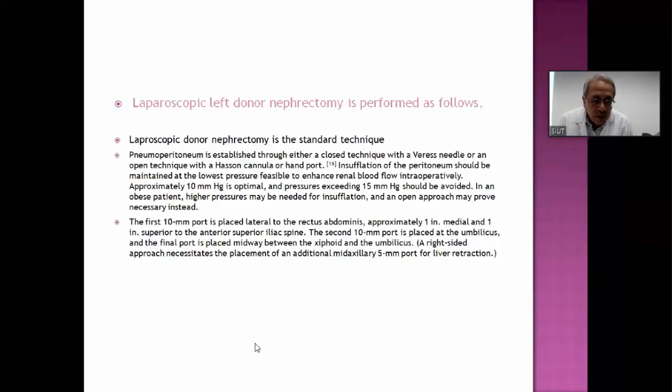The second thing is that excess pressure will always cause the vessels which you are dissecting to go into tamponade, to go under higher pressure. So, for instance, if you are doing dissection and there is some bleeding from a smaller vessel or some capillaries, as a surgeon you want it to be in front of you so that you can take care of it.